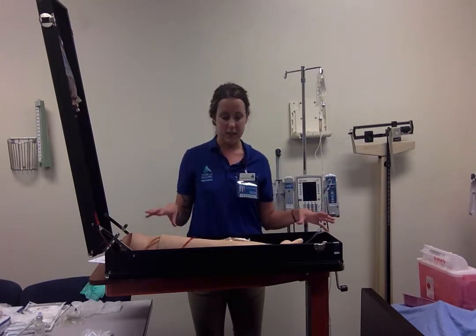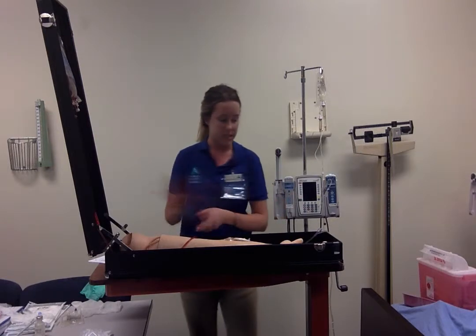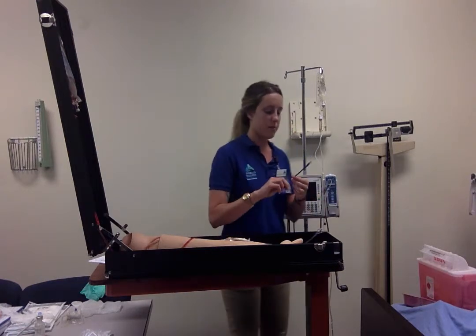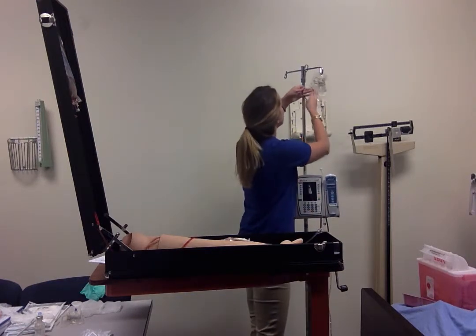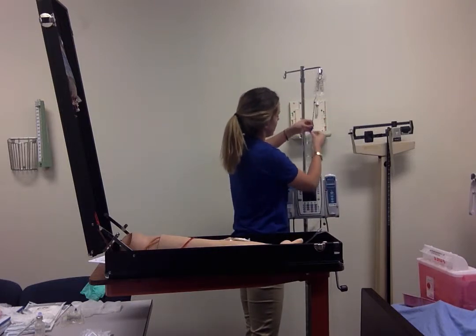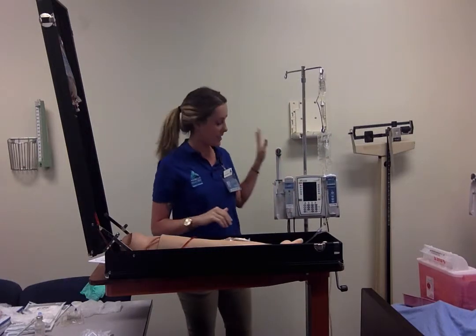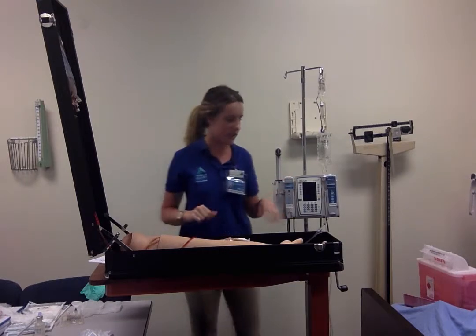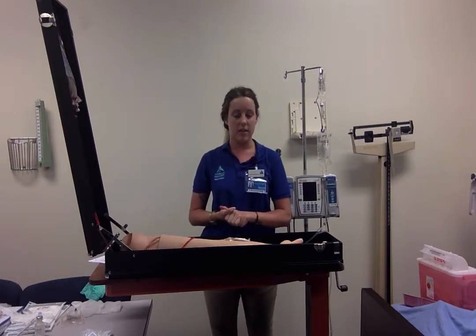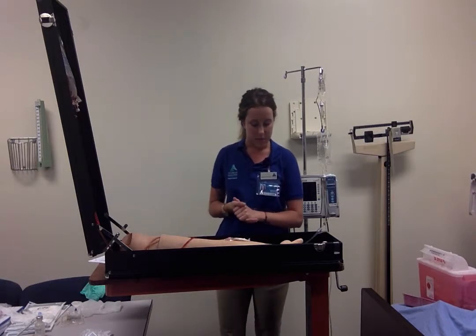I'm going to get all of my stuff cleaned up and let the medication run for about 30 minutes. I'm going to take my gloves off, wash my hands, dispose everything in the sharps, and really quickly before I leave, I'm going to make sure this is set below the piggyback. So everything's good. That's going to be set for about 30 minutes. I'm going to make sure the patient has their 4 Ps: the positioning, the pain, to the bathroom, or any possessions they might need. I'm going to leave.